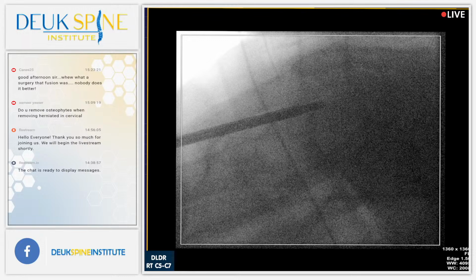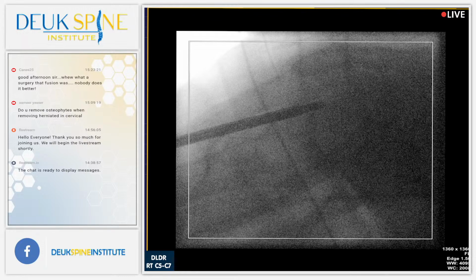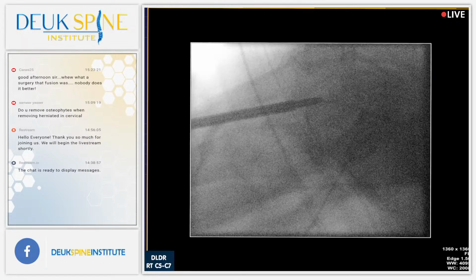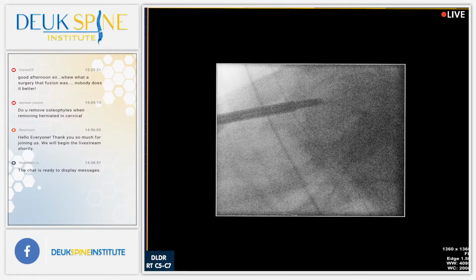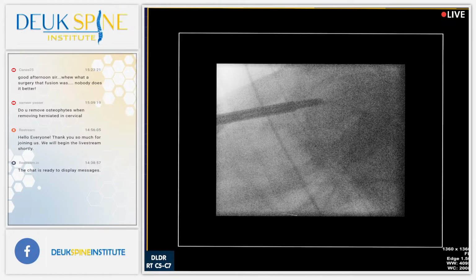Any way you can clean that up a little bit? I need it cleaned up just a little bit more. It's not any better. Looks like we're just along. Skiving. But the problem is I can't get the angle I want because this clavicle is right here. It's forcing me north. But that's not terrible where you are there, Jordan. I just think we're hitting that same material as we did last time.